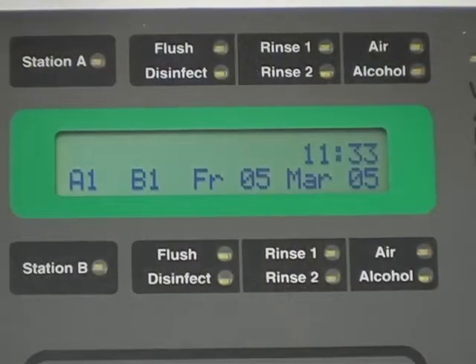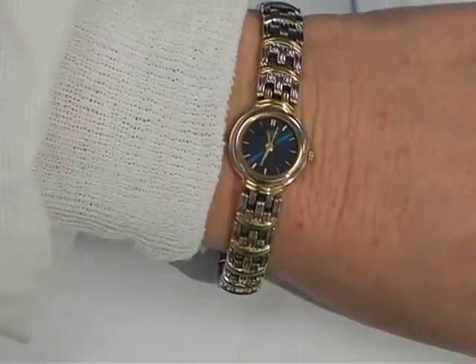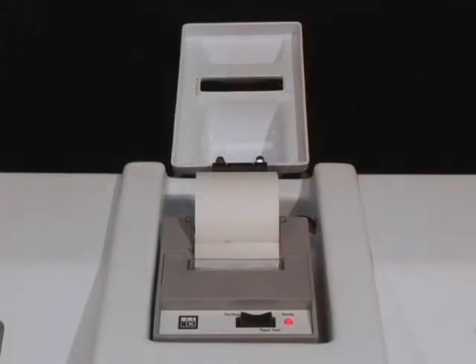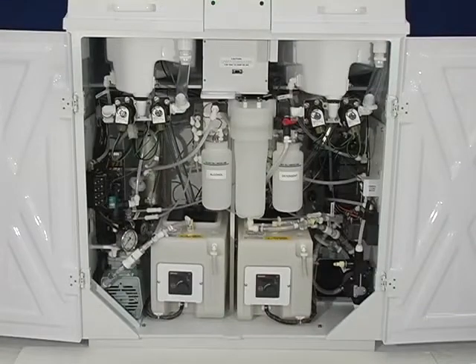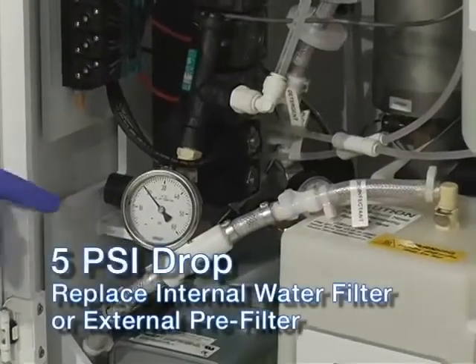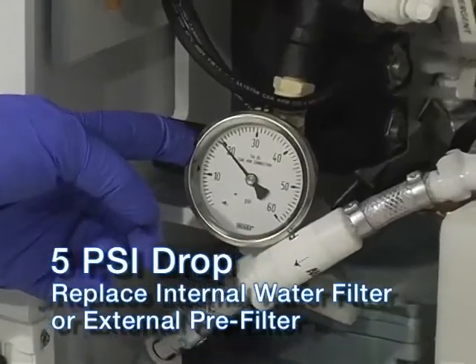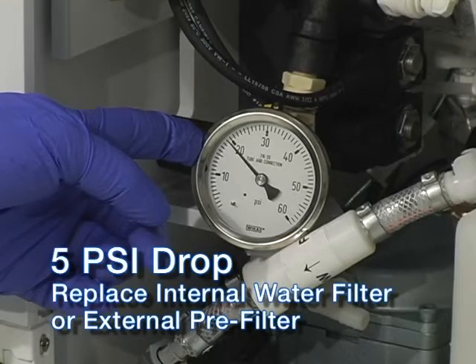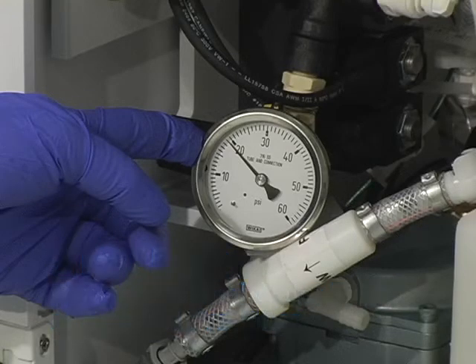Check the time indicated on the control panel display for accuracy. Instructions for resetting the time will be explained later. Finally, check the printer paper supply. When you are disinfecting the first endoscope of the day, check the water pressure while the DSD-201 is in a flush cycle. If the pressure has dropped 5 or more PSI from the target setting of 20 PSI, it is a sign that either the pre-filter or the internal 0.2 micron filter is saturated. Replace the appropriate filter as soon as the endoscope disinfection cycle is completed.